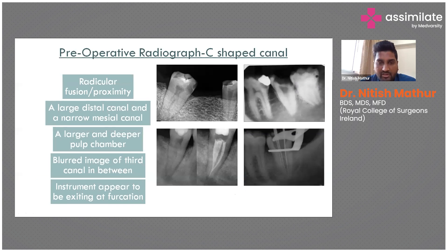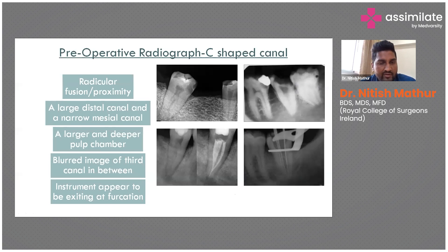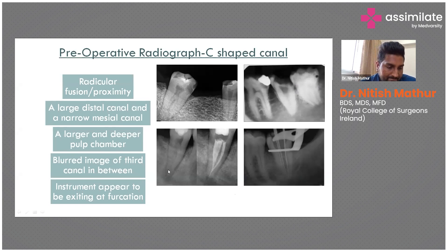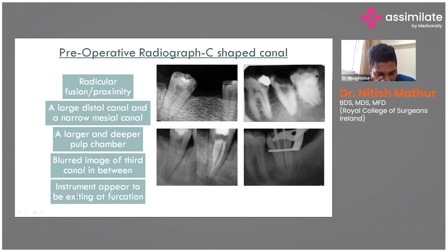C-shaped canals fall under complex root canal anatomy, and CBCT is indicated, but we can still identify a C-shaped canal from an IOPA. Five radiographic features should be assessed to suspect a C-shaped canal.